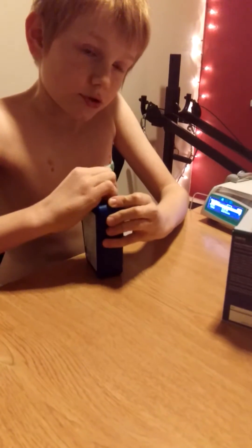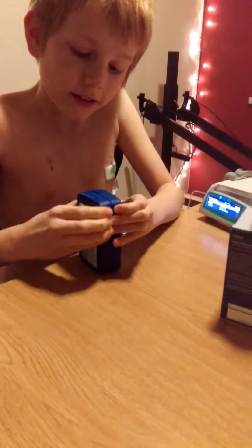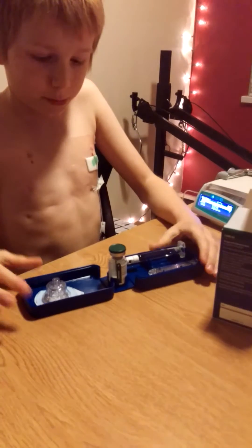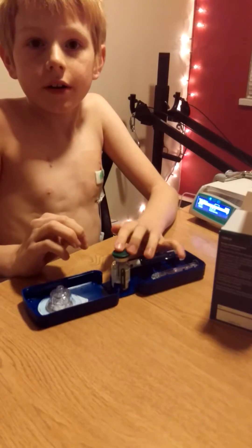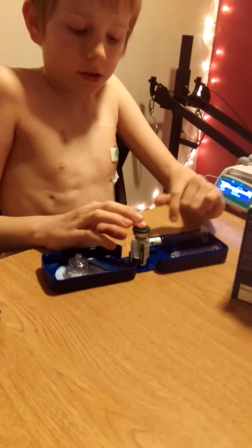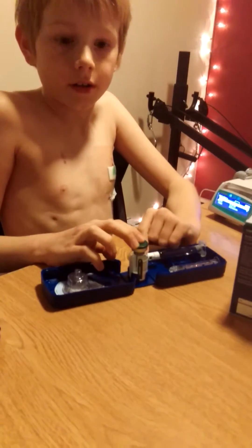Parker, can you turn the TV down please? Just pull it open like this and then it opens up for you like this. Okay, I need an alcohol swab for this one.